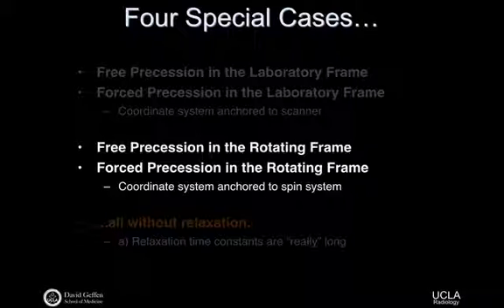It's mathematically motivated that this term will basically just subtract out the B0 field. This is what demodulates anything that shows up in B rot. It's always going to look the same so long as we're demodulating by the B0 field. It could look different if you were trying to do something slightly different.